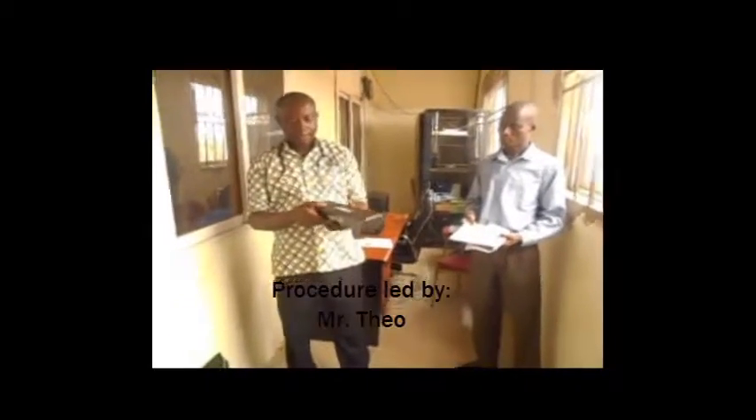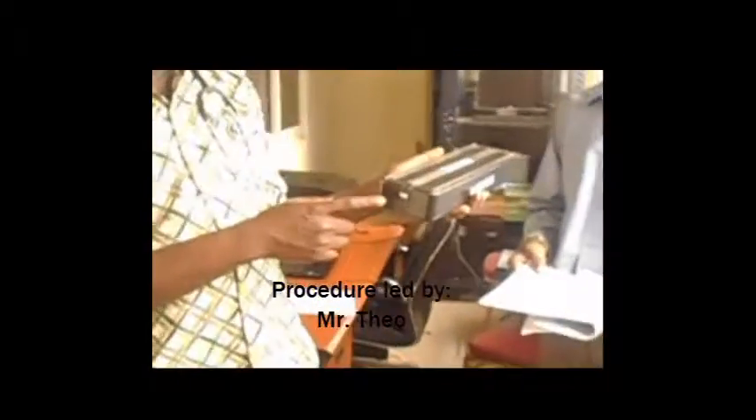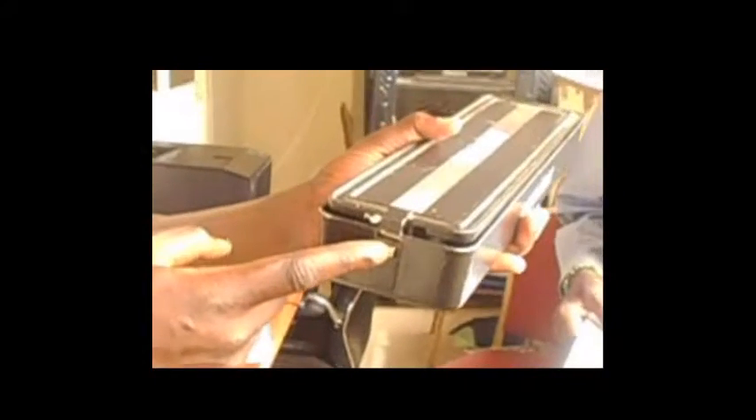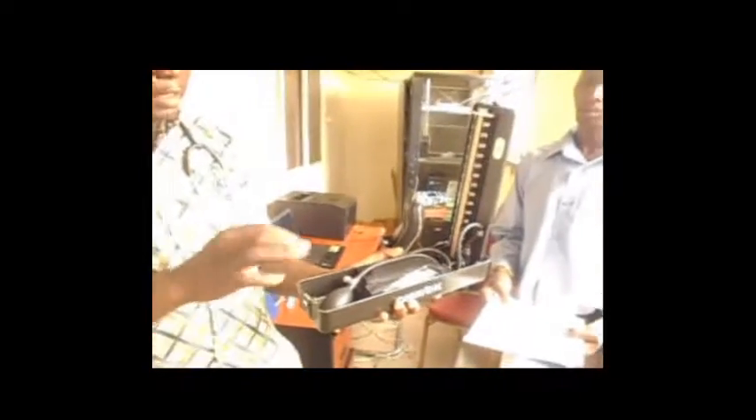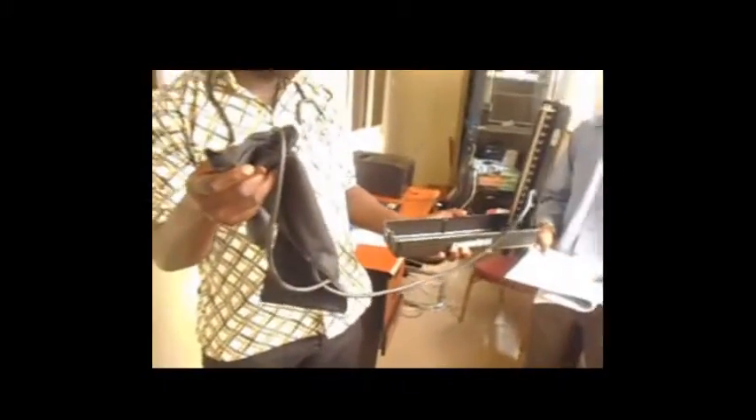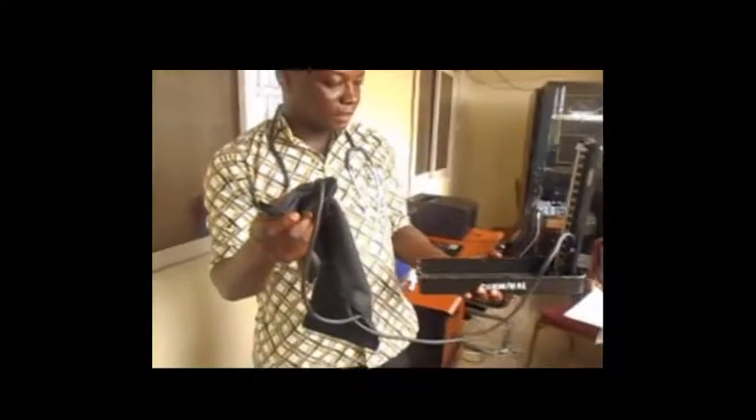This is the Mercury Sphygmomanometer. This is how you open it. You press the knob here gently, then it opens. You gently open it up, then apply a little pressure to stabilize it. Inside it contains some essential components necessary for the process.